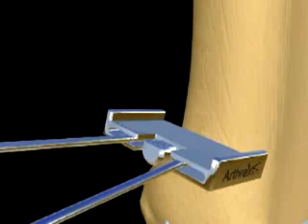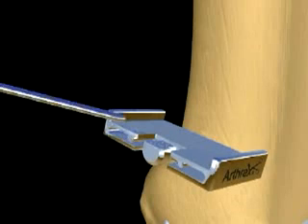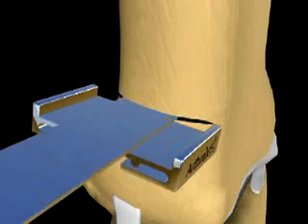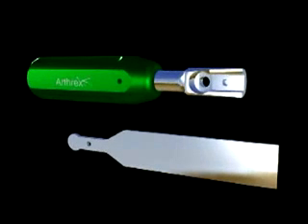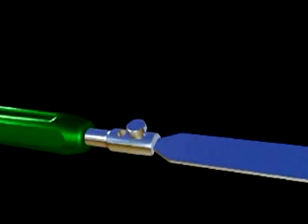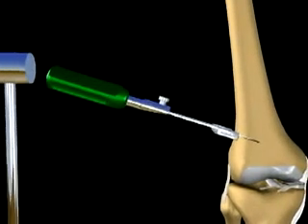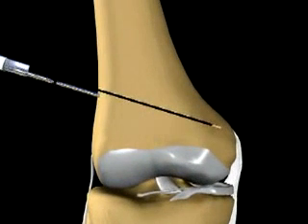Once secure, the breakaway pins are shortened and a sagittal saw is used to perforate the femoral cortex superior to the guide pins. Osteotomes in a variety of sizes are used to complete the cut under fluoroscopic control. The depth markings on the osteotome blades may be referenced to the breakaway pins during this portion of the procedure. The osteotomy is made until a cortical hinge of bone is left medially. Once the osteotomy is complete, the breakaway pins are removed.